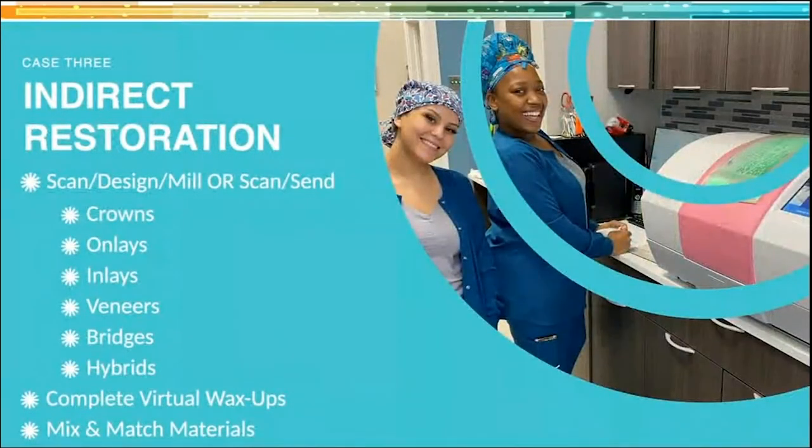The third case I want to talk about is an indirect restoration. In the photo is Caitlin and Dries, my two fantastic assistants, and our 30S mill pictured. So with this type of technology and the Emerald S, of course, you can scan and send it to a lab, and they can design it, and they can mill it for you, or they can send it back to you, and you can mill it in your office, or you can keep it all in-house and scan, design, and mill. This equipment can do anything from crowns, onlays, to inlays, veneers, bridges, hybrids.